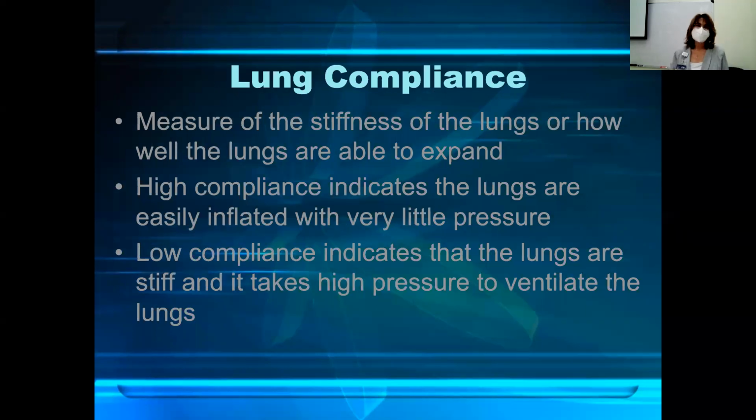All right. So the next concept we're going to talk about is lung compliance. It's a very important topic to understand and apply. It's a major part of ventilating a patient. So very important to understand lung compliance. And lung compliance is a measure of the stiffness of the lungs, or you could say it's how well the lungs are able to expand.